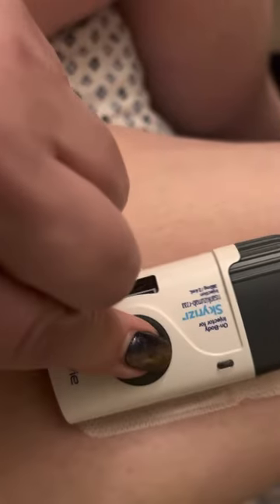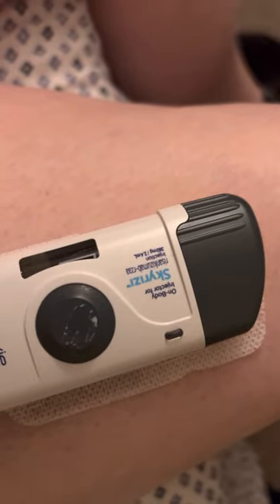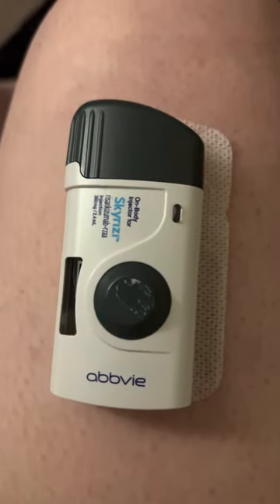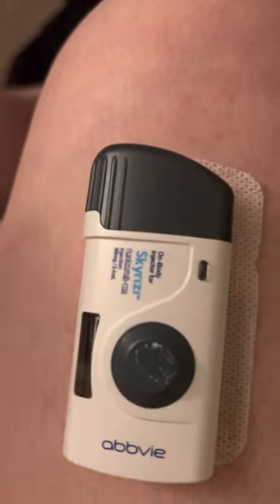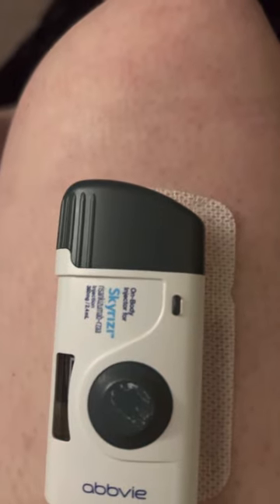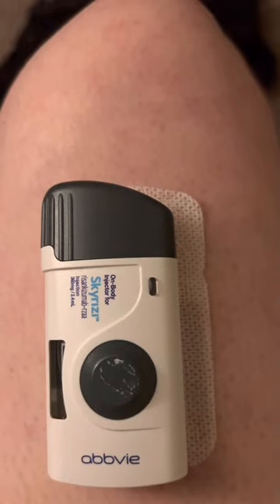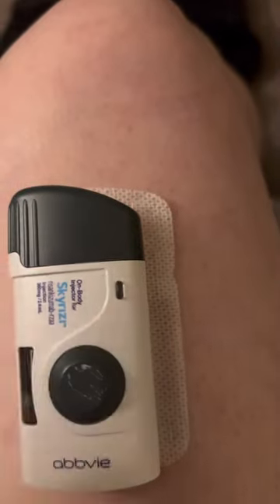I'm just going to push — and push on the button. Ouch. We're good. And that's it, guys. That's how you do your Skyrizi at-home maintenance dose. When you remove the device, you're going to have a little bit of liquid come out, and that's okay.